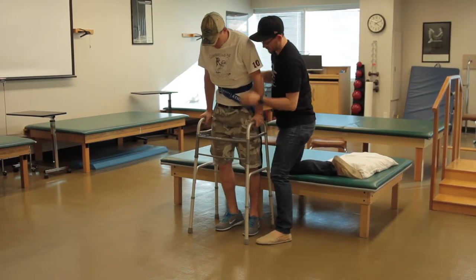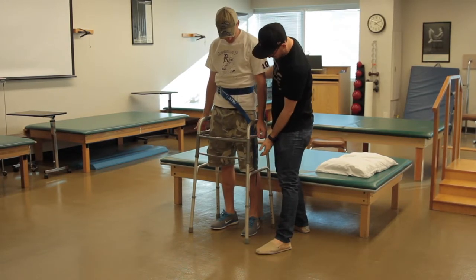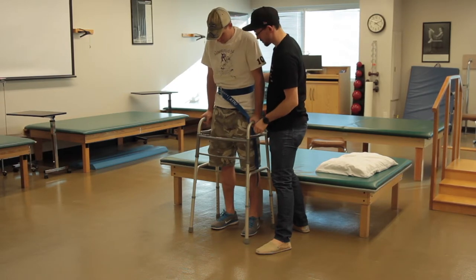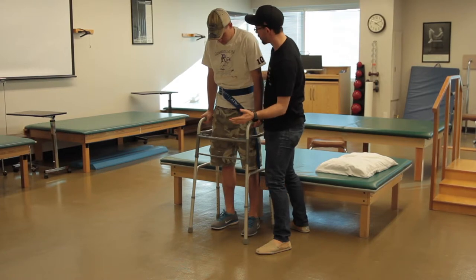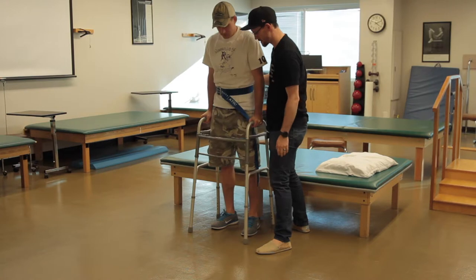Good. All right, so I just grabbed this walker. Can you just leave this left arm down? That's great. This is the height that we want it at, right at the break of the wrist. So in case, this is the walker up here at the hospital, but when you go home, make sure that it's at that break of the wrist. So it's a good size.